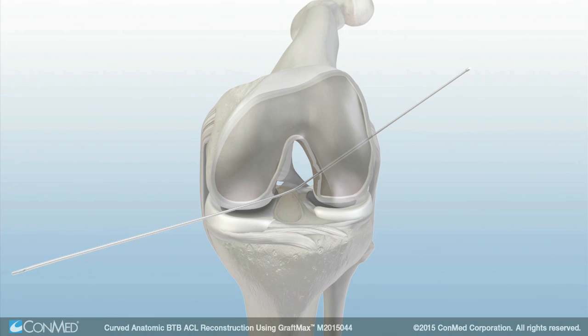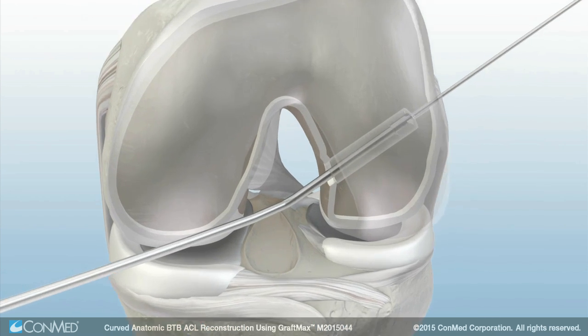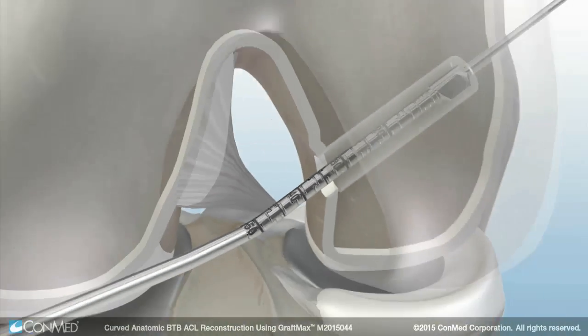Then advance the FlexExact pin out through the skin laterally. Next, insert the GraftMax FlexSentinel reamer over the FlexExact pin, keeping the cutting flute away from the femoral condyle.